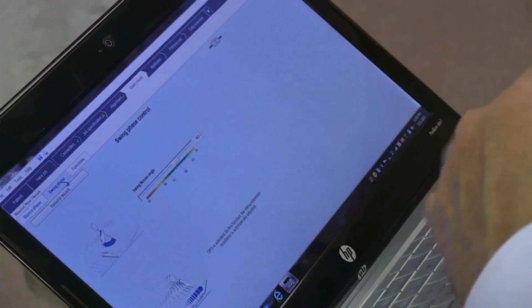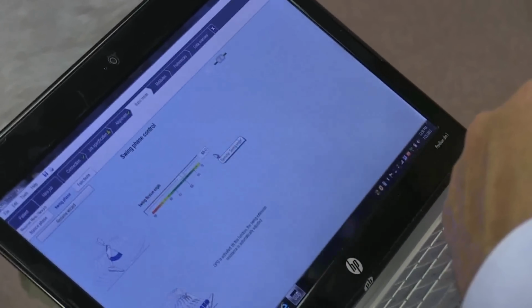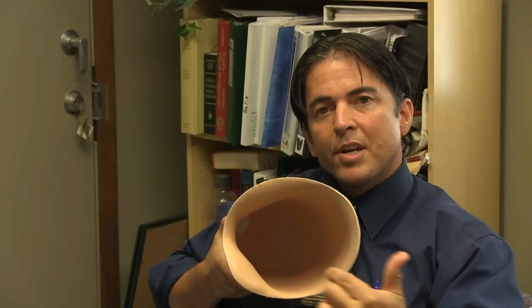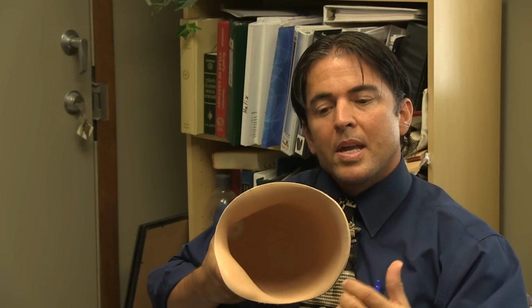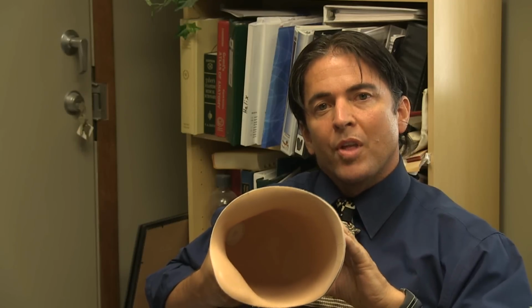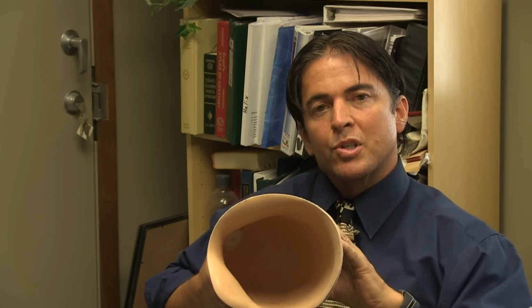And I have an example here of a traditional design, and if you notice inside, you can see that it's fairly generic in its shape. It doesn't have a lot of contours. It basically fits around the limb and adopts the shape of the person's limb.